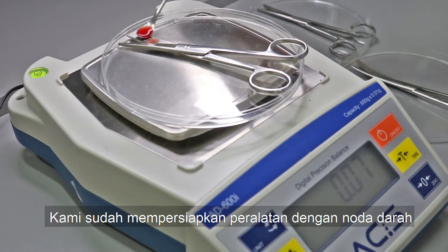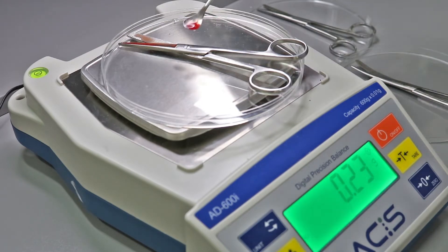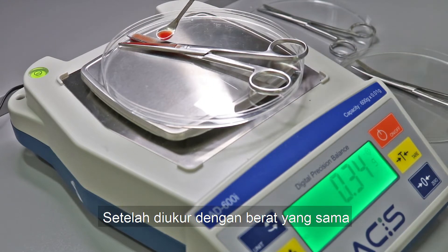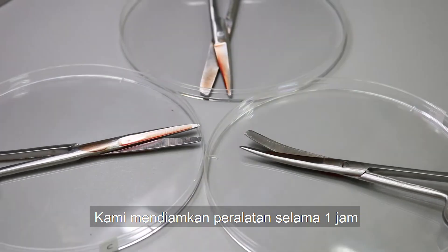We have already prepared the surgical instrument with a blood stain. We spread the blood on the instrument surface. After being measured with the same weight, we left it for one hour for the blood to dry.